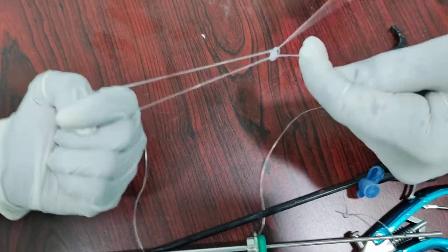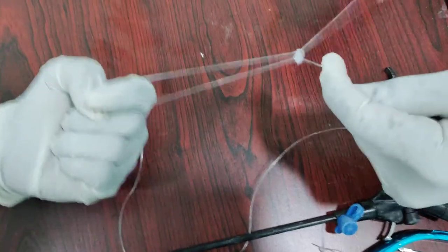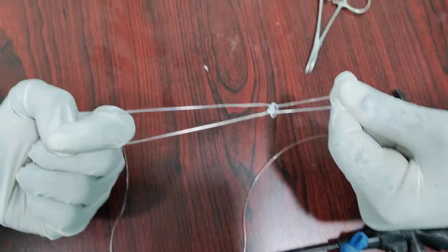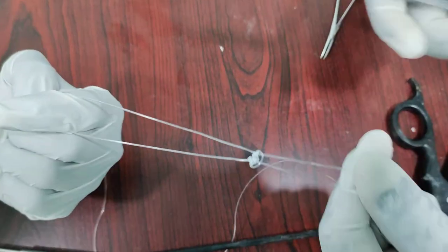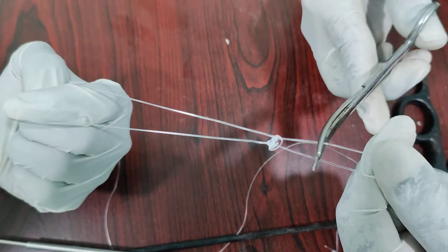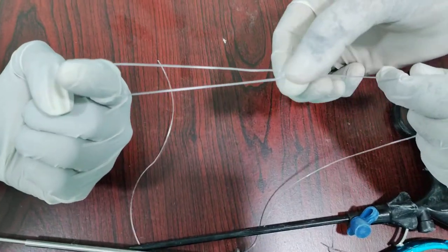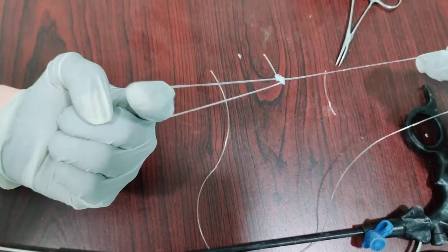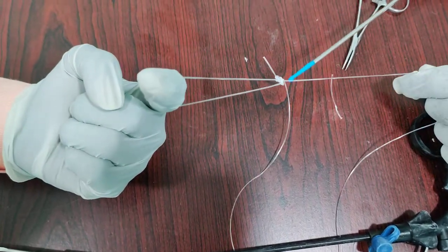Now, tighten it, cut the extra length of the suture, then push it with a suture passer.